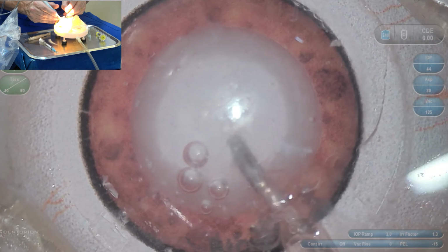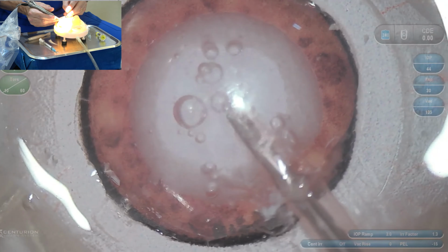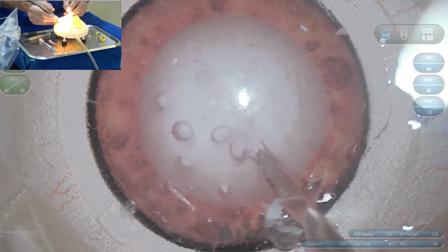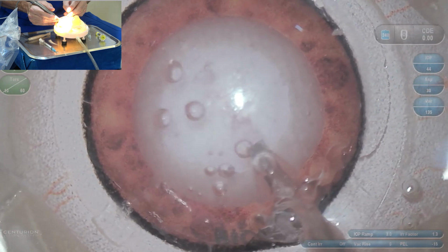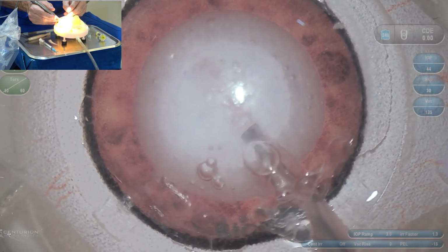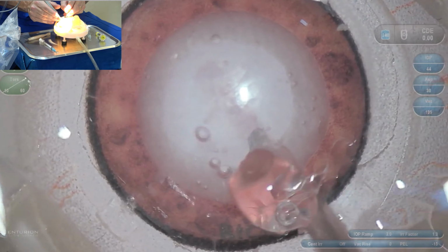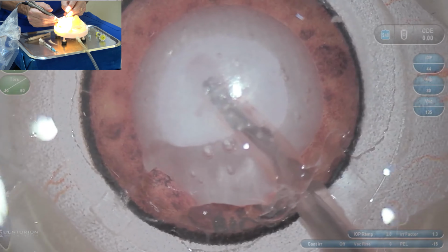If it's too big, you can always rotate it and do another small trench, or you can bring it to the anterior chamber and start doing some chop. Again, when you're beginning especially, I recommend you do another small sculpting, so you have 2 fragments, and then you go deep and you crack it. Look at that beauty. It's amazing. Now I have a very small quadrant.